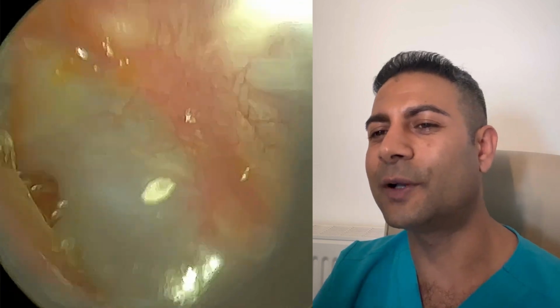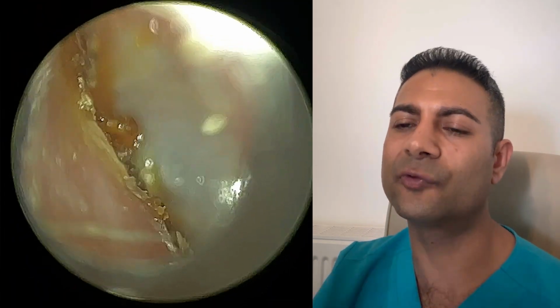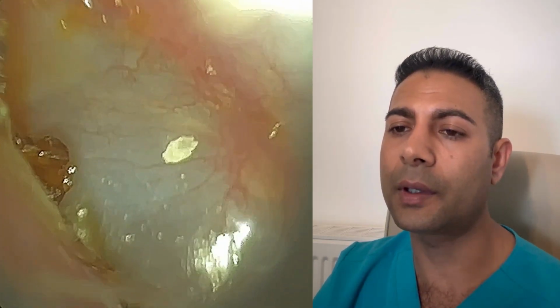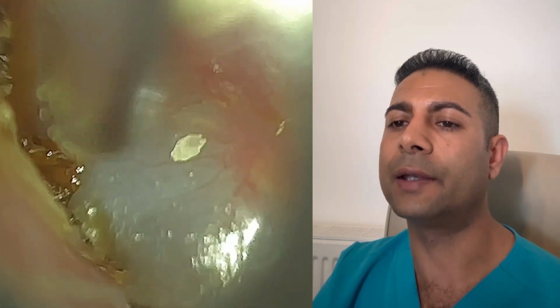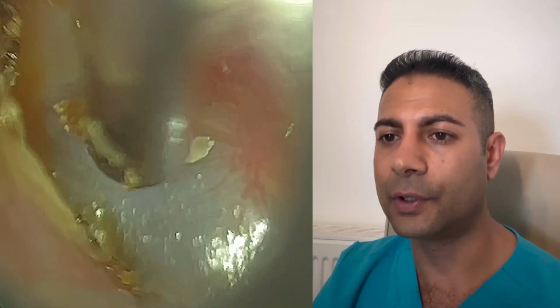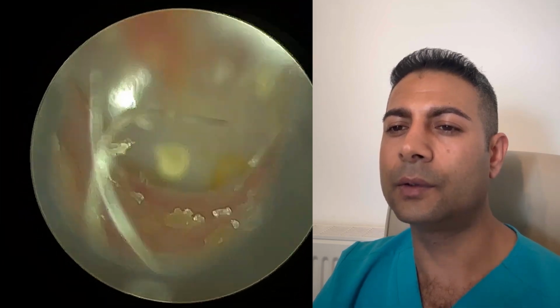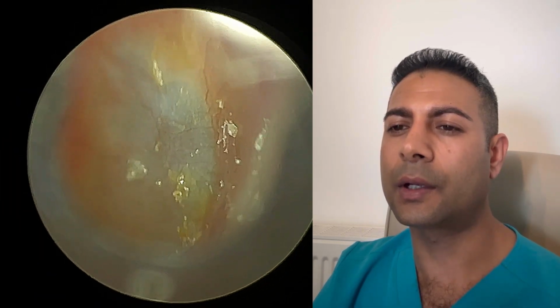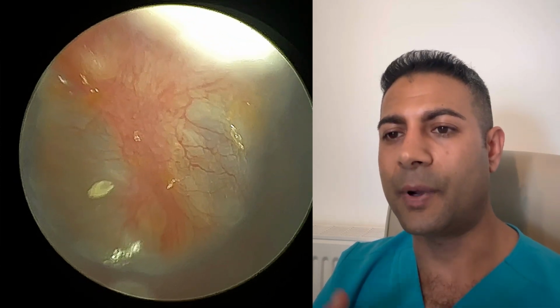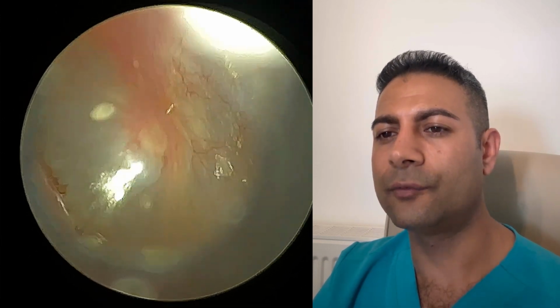Now, of course, if it was becoming uncomfortable for the patient and I felt I was at risk of perforating the eardrum, we would stop. But this patient is a frequent attendee to the clinic, and they're very still, they understand the procedure, and I feel really confident working this close to the patient's eardrum. And I think more or less I've cleaned that, so there is a bit of debris here and there, but I think by removing all these little pieces, I am pushing the boundaries a bit, and I don't want to do that. Really, really pleased with that.